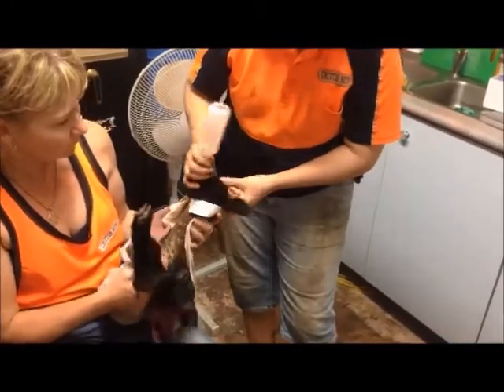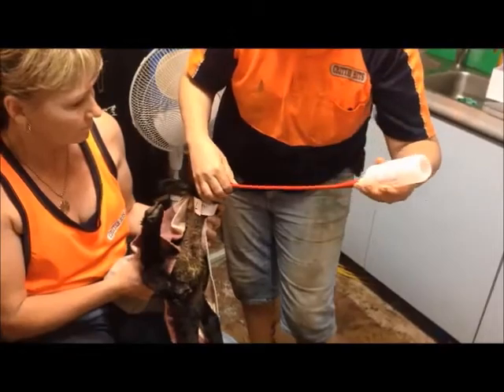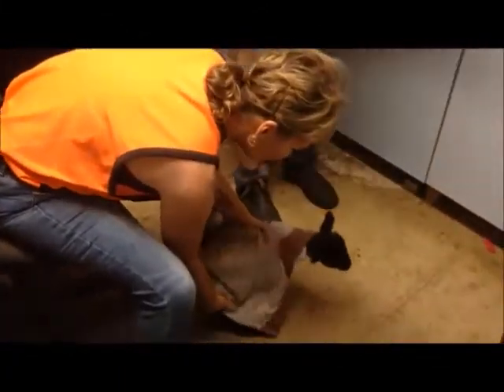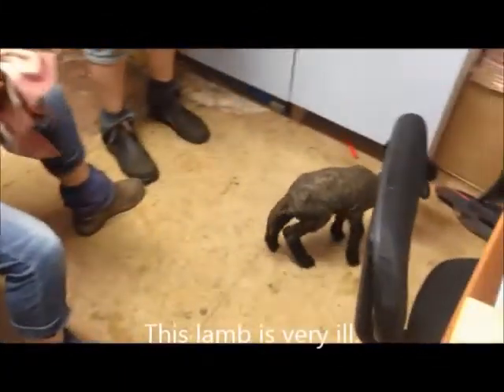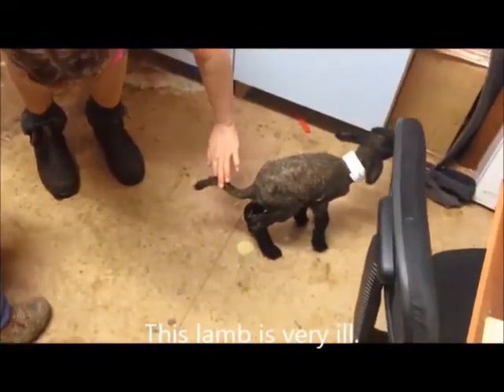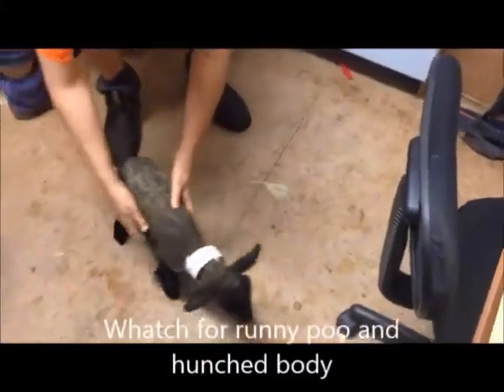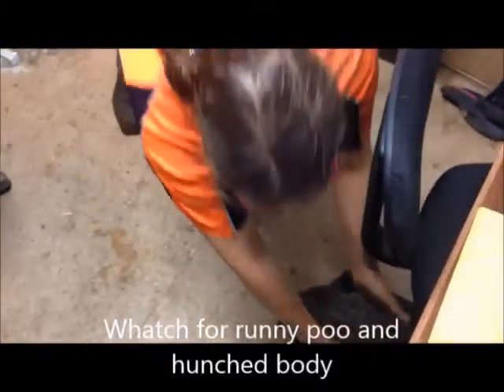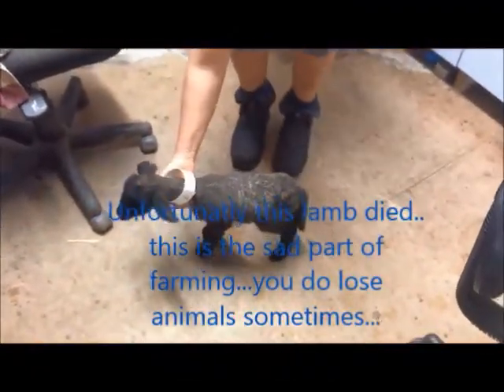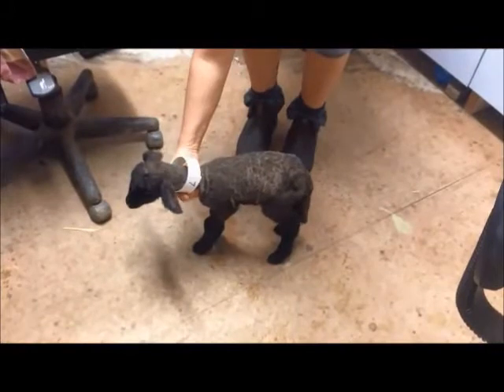Okay, that's probably about it — now we just take that out and pop it in the sink. You can just put the little lamb on the floor. See how she's really hunched? She's got a bit of diarrhea — see that? Not a happy little lamb. When anyone says to you that the lamb's looking flat, that's what it looks like: hunched up, uncomfortable, very runny poo as you can see on the ground. So we'll give you an update on her and see how she goes — but it's definitely electrolyte she needs.